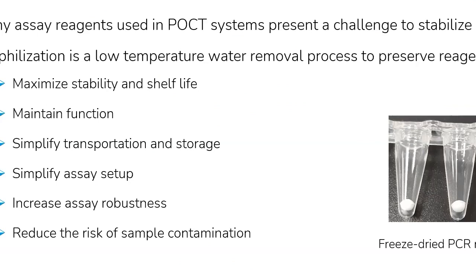Lyophilization is a low-temperature water removal process typically used to preserve reagents to maximize the stability and shelf life, maintain function, simplify transportation and storage, simplify assay setup, increase assay robustness, and reduce the risk of sample contamination. In addition, lyophilized reagents can also more easily be added to the different test cards and platforms without the risks of the reagent clogging up the systems, if the reagents need to be stored on the test cards for a longer period.